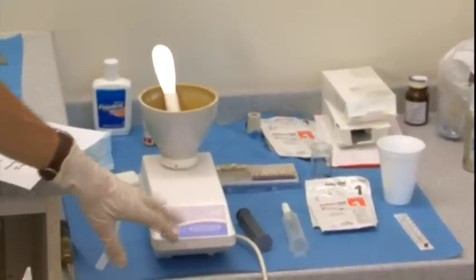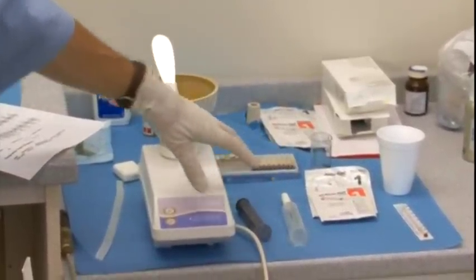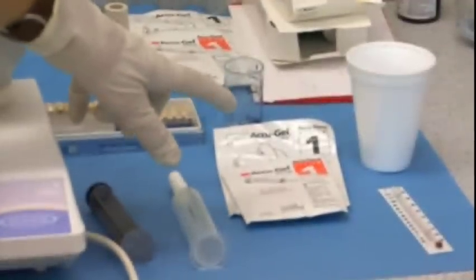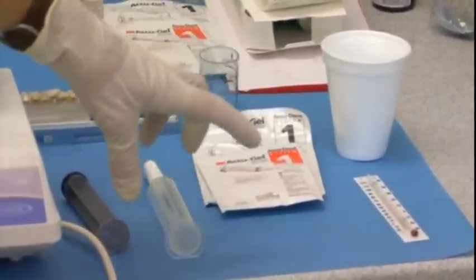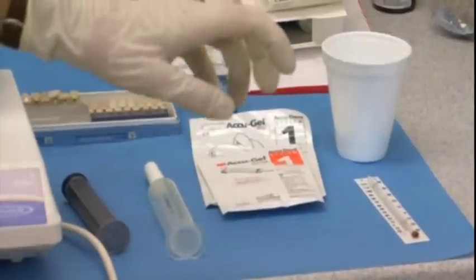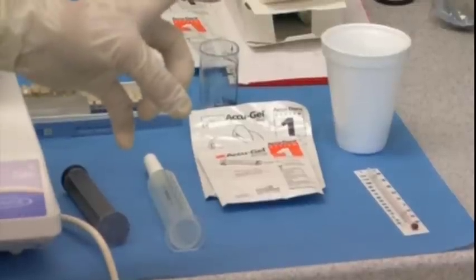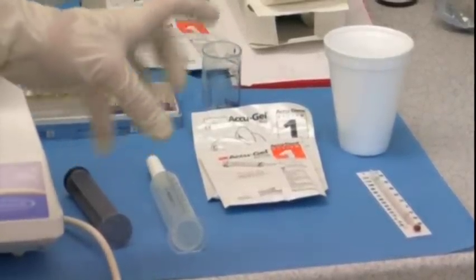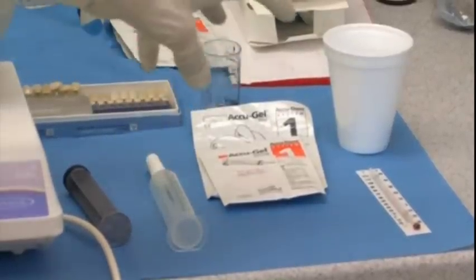Kathy's got it all laid out. We use an alginator, which is an automatic mixer. The AccuGel system comes with an injectable or light body, and then a tray material — a heavy body. We use a thermometer because the material recommends the water be between 80 and 85 degrees when you're mixing it. You really need to use your thermometer to get the temperature right or your mix doesn't do well.